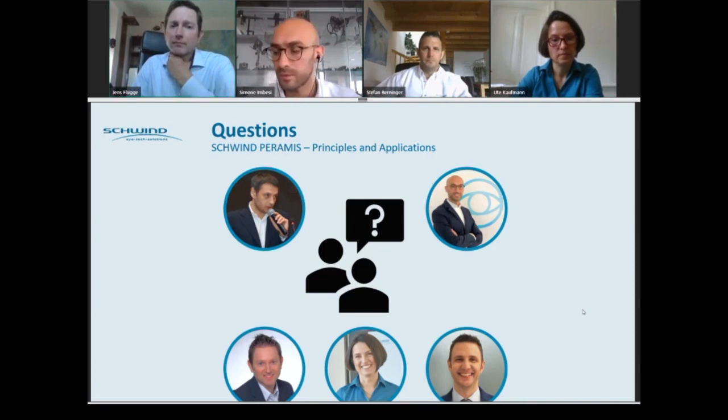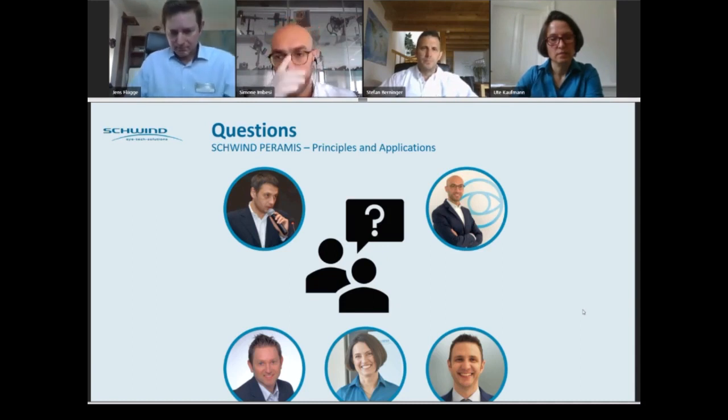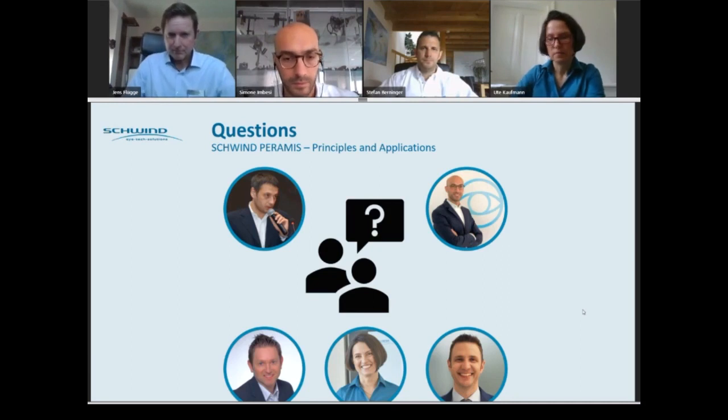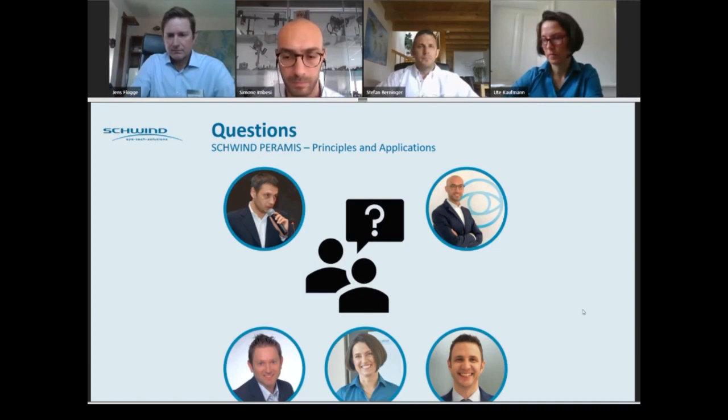Probably this question has the same answer as the one that I answered before. If we can define some good metrics to evaluate the quality of the wavefront, and such metrics are the Strehl ratio, so the quality of the peak of a PSF, we can try to remove the high order aberration components and see what is the optical best solution that minimizes the size of the PSF or maximizes the Strehl ratio.